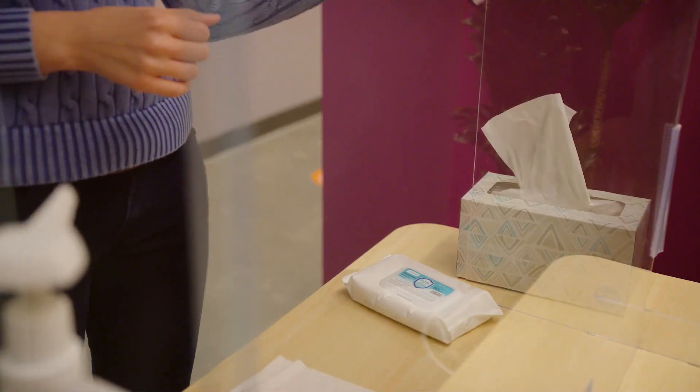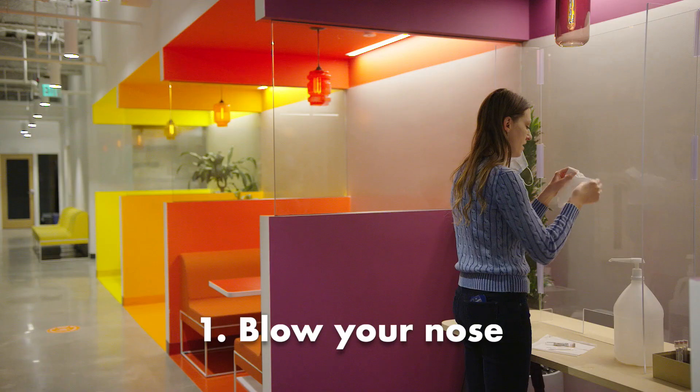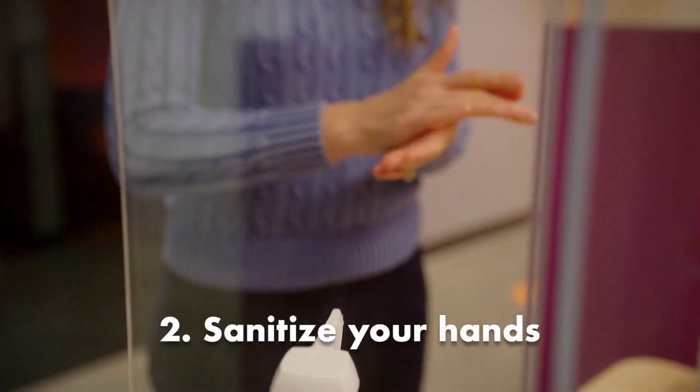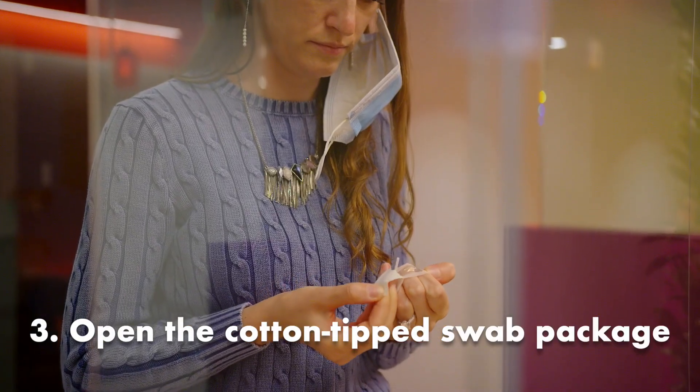Here's a step-by-step. You'll blow your nose, sanitize your hands, and open the cotton tip swab package.